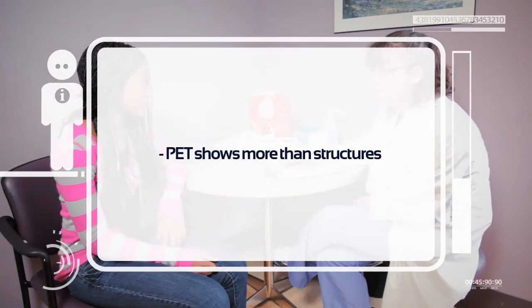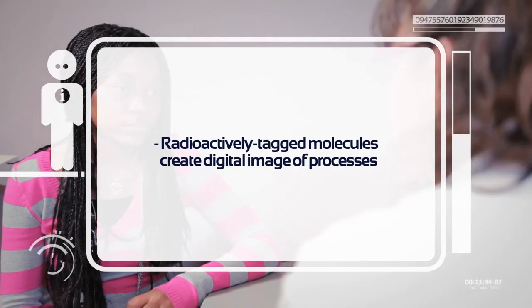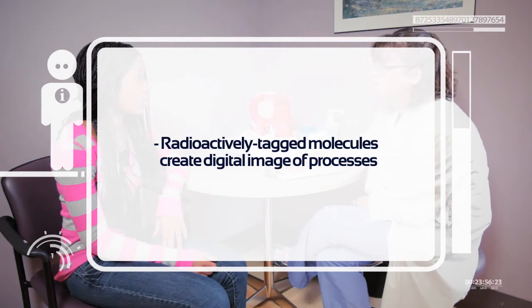She explained what I would experience here. Unlike techniques like x-ray or MRI, PET doesn't just show structures. It uses radioactively tagged molecules to create a digital image of processes happening in a body's cells and tissues.